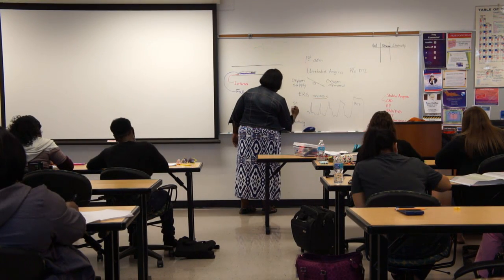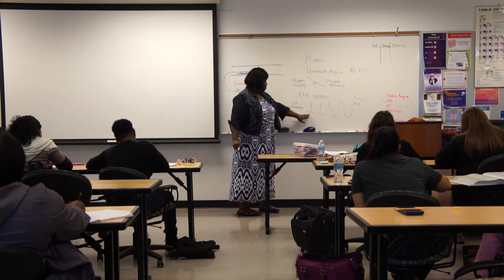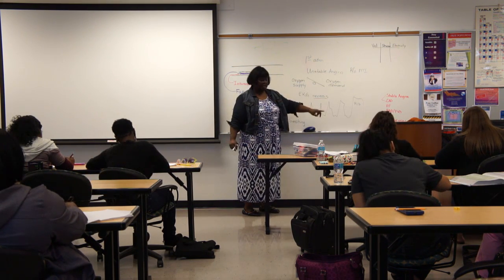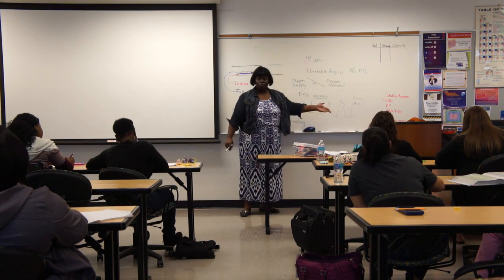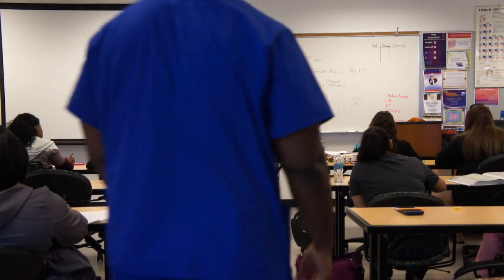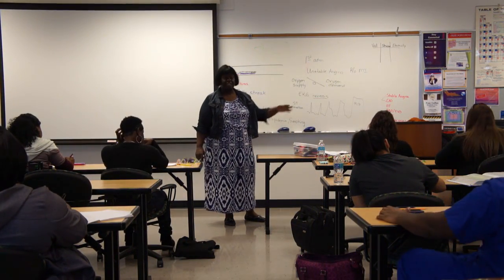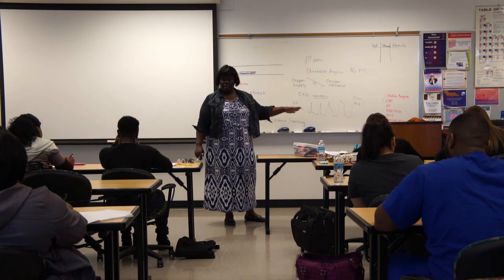They have ST elevation. So you look at the ST segment here, stays here. When you get it 30% of what the baseline is, see how high it is right here? And then you'll end up with what they call tombstones. That's exactly what they call them on an EKG strip. So that's why I got the rest of the piece over here, because that's telling you that's tissue death. When you see that on a patient, that's very bad.